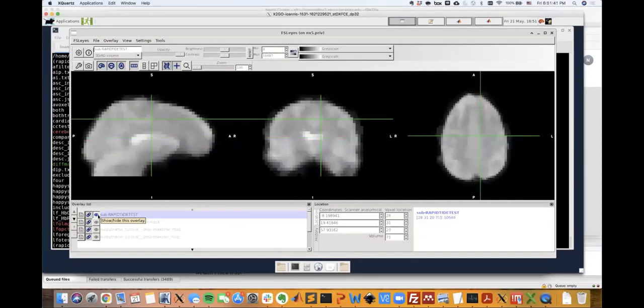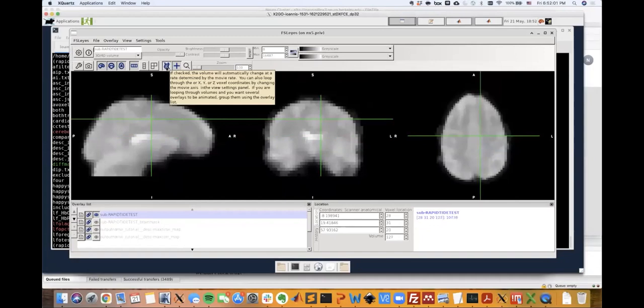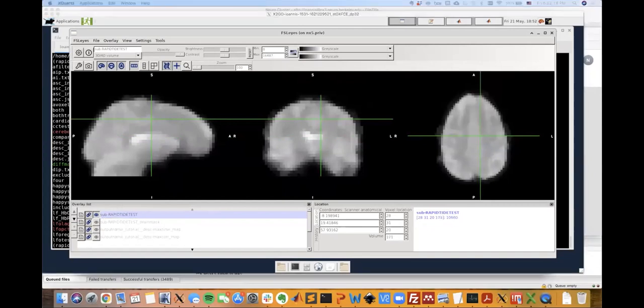The way that I usually do my pre-processing for RapidTide is I slice time correct, I motion correct, and then potentially I smooth, although the latter can be done within rapidtide. So as I mentioned, you don't need to do any fancy pre-processing. The basic pre-processing that involves motion correction, slice timing, and potentially some smoothing will do for your data. Okay, given that you have your data and that it is minimally pre-processed, we can now run rapidtide.